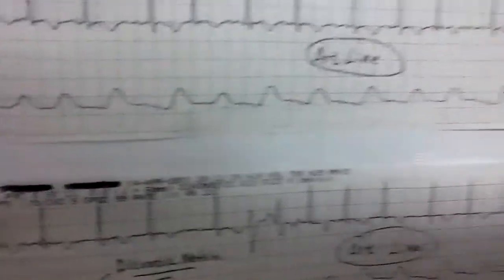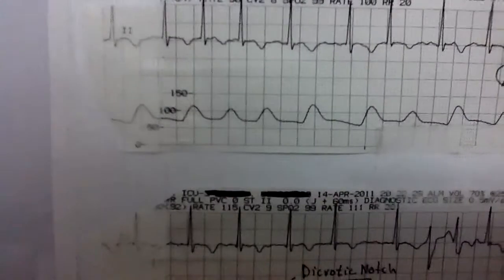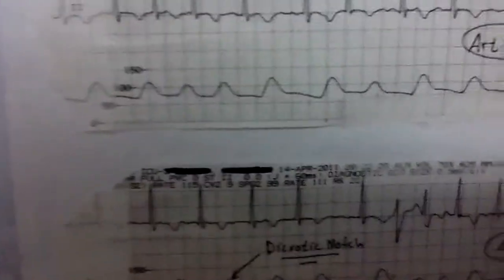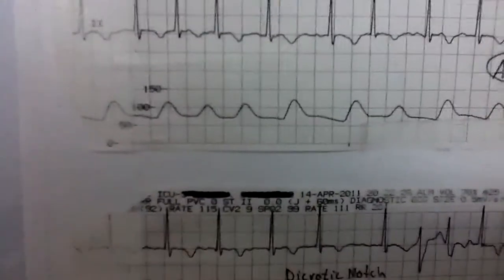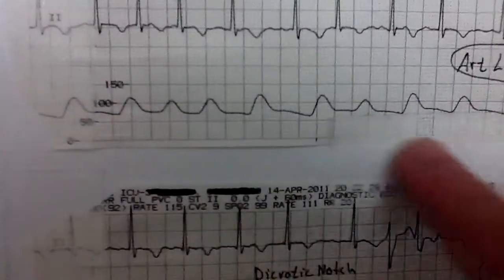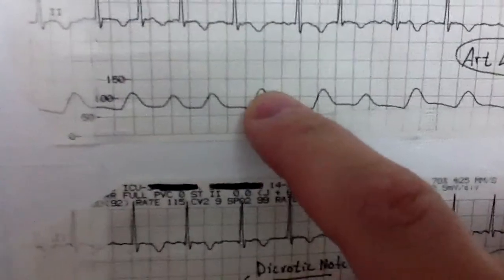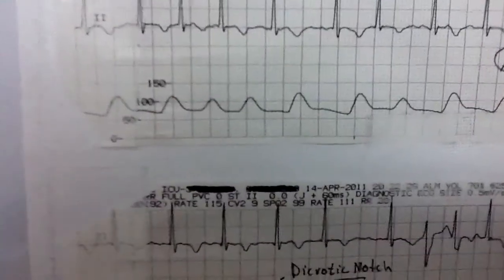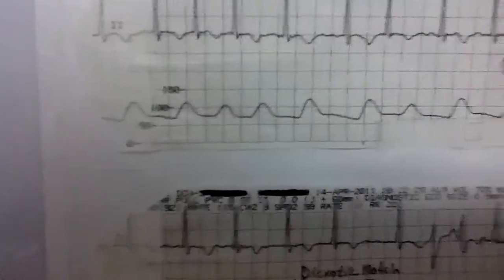As you can see, this is very characteristic of the kind of waveform I talked about earlier, where you may have some aortic valve dysfunction. Maybe this person is a little older or maybe they have some underlying issues. You often will get just a rounded waveform where you don't have a clearly identifiable dicrotic notch.